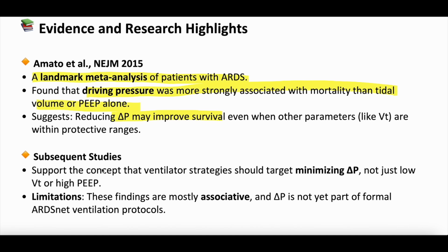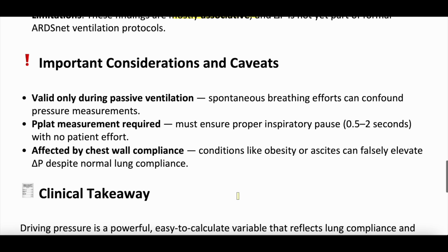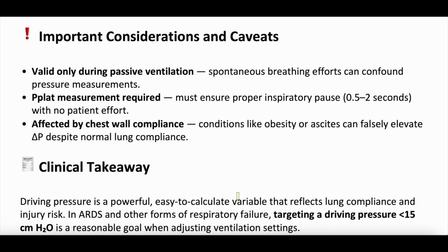There have been subsequent studies that support this concept that you should be targeting a lower driving pressure, not just tidal volume or PEEP. But most of these are associative studies. There hasn't been, at least as far as we're aware, these robust RCTs, although they probably will be coming, so stay tuned. When we think about important clinical considerations and caveats, again, this is really only valid during passive ventilation.